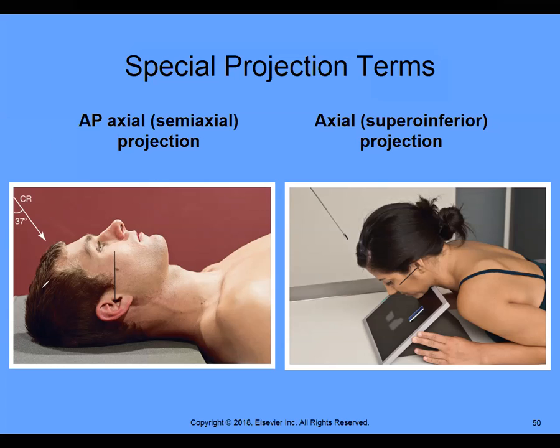So let's identify first again. This is the long axis of the body, or we're going to say the long axis of the head, right? And then this other part would be the short axis, because it's shorter from here to here and longer from here to here. I'm going to pretend that over here is our X-ray tube. They didn't take a picture of it, but we're going to pretend that we do. Our X-ray tubes allow us to angle. Again, I'm going to pretend like this is an X-ray tube.